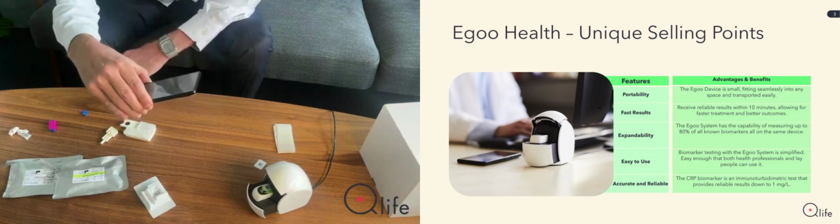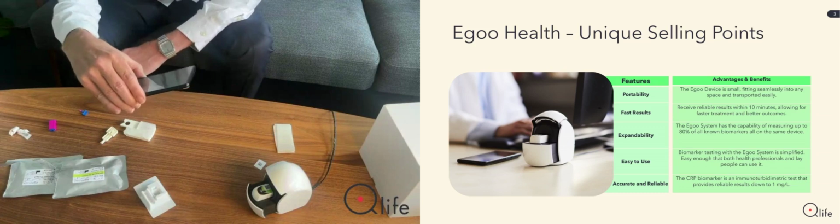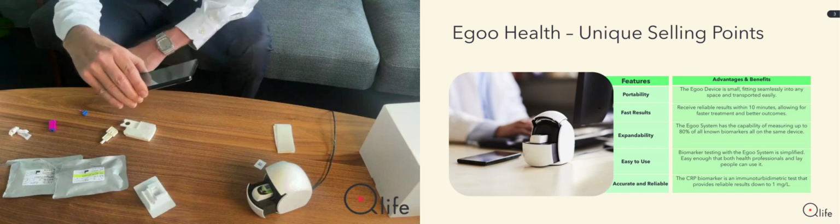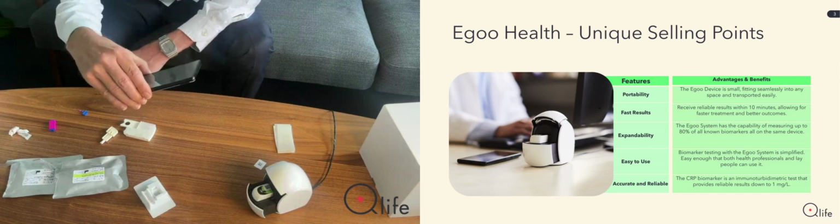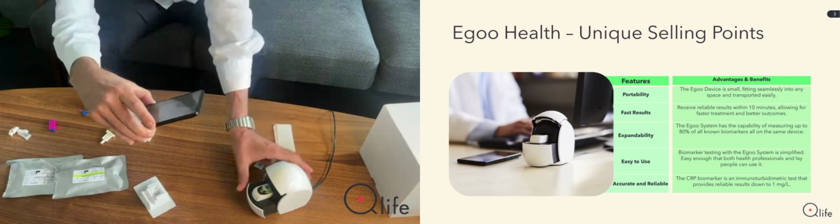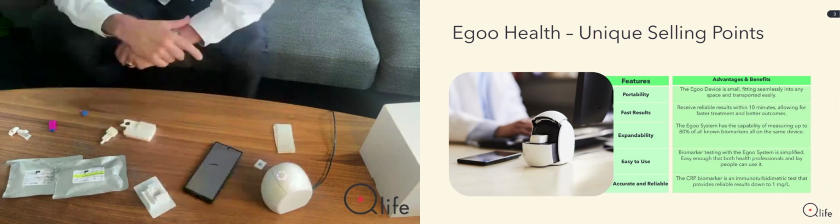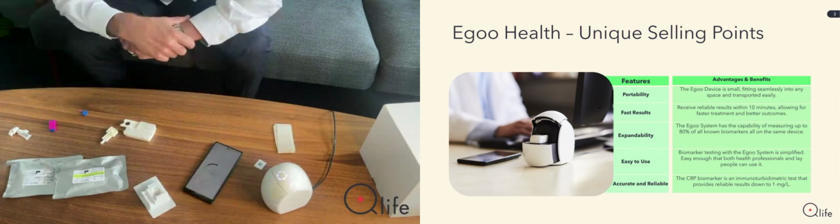Okay. Yes, and then now the device knows. And during the analysis, it connects to the cloud several times. It transfers raw data into the cloud, and the actual data generation or the result is calculated in the cloud, where all the mathematical power lies, and then it's transferred in the end of the analysis to your smartphone. And now you can close, and then basically the CRP test starts.